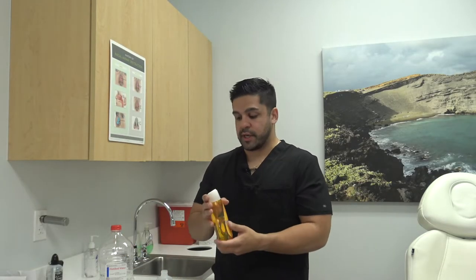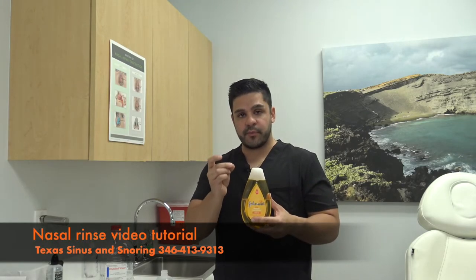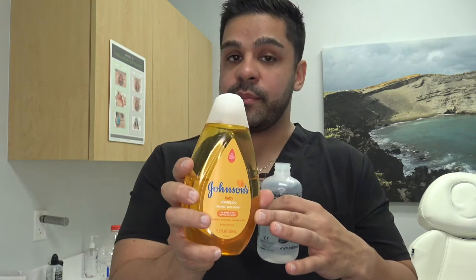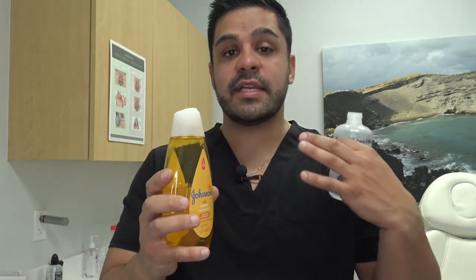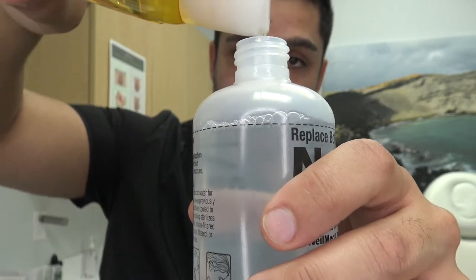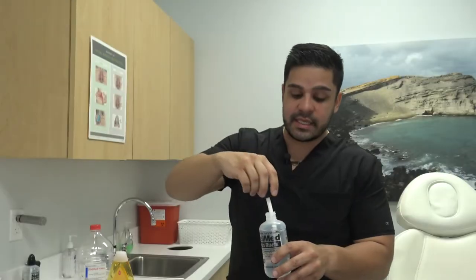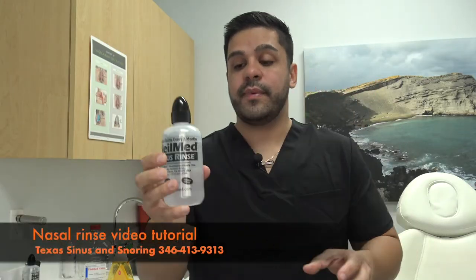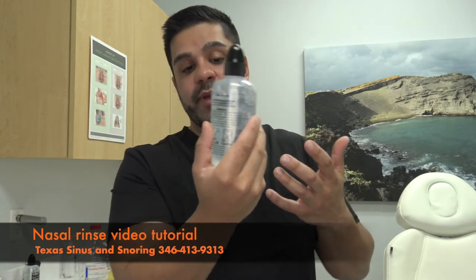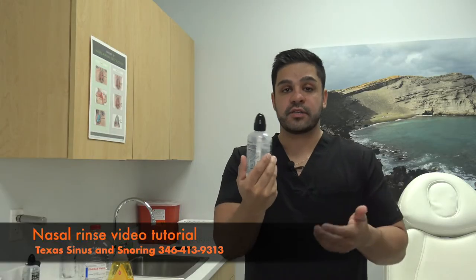Now that we've covered the salt packet and medication, the last thing I want to mention is adding a tiny drop of baby shampoo into the NeilMed Squeeze Bottle. Studies have shown this to be very effective. It's important to use baby shampoo specifically because it doesn't have all the chemicals of regular shampoo — it's soothing to the nose, acts as a surfactant, and cleans up a lot of the debris that might be stuck in the nose. Add just a tiny little dollop and, rather than shaking vigorously, swirl it gently to allow the baby shampoo to dissolve into the solution. We highly recommend this, especially if you are a Dr. Cilento patient.